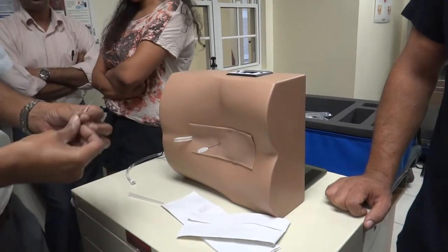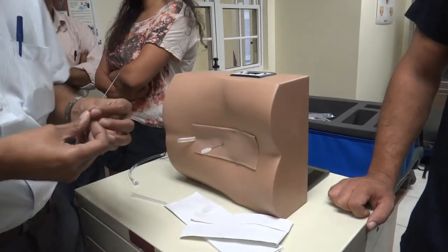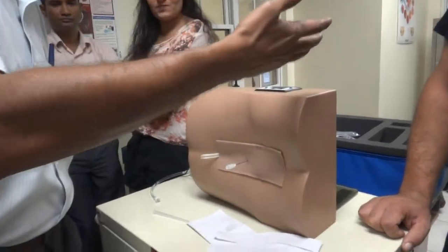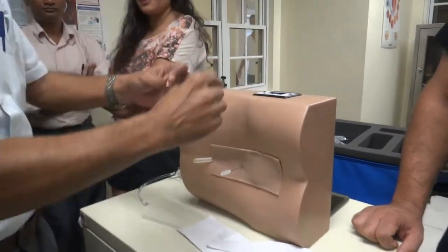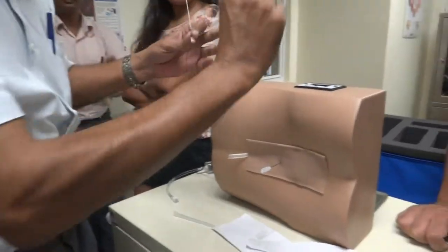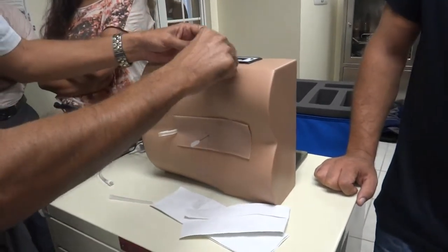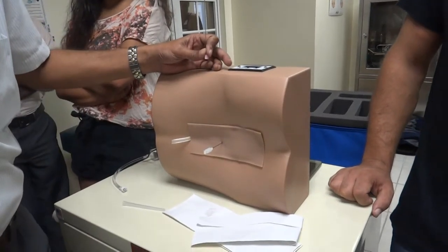Once you've collected the CSF, what we don't have here is the manometer. It's a long burette with graduated markings on it, with a three-way stopcock. You can connect it here, and the reading will be the CSF spinal manometer.